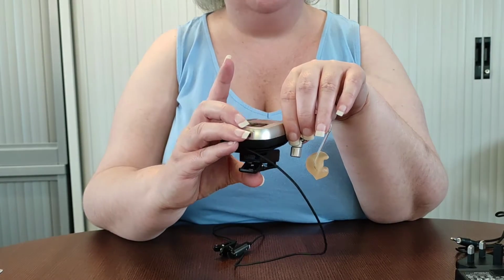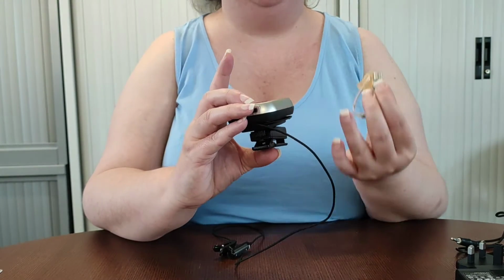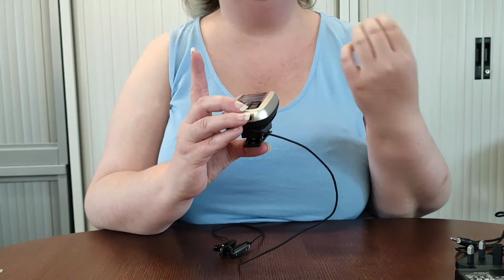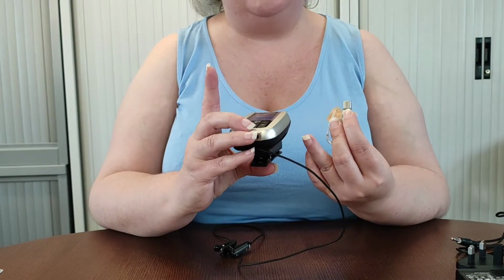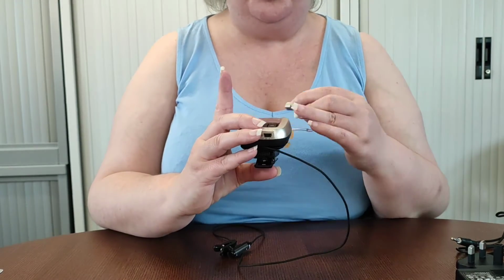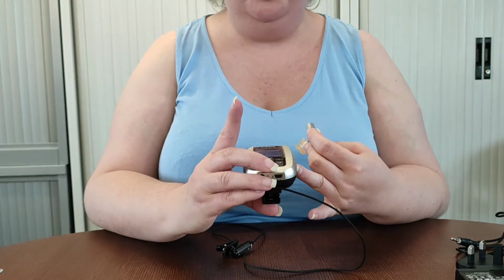And then the screen will say that it's connecting, and then it will say whether it has connected or it has not. In this case it hasn't because it's not actually attached to the hearing aid, but it will be set up by your qualified teacher of the deaf or the technician, so that shouldn't be an issue. If it's connected, then we need to wear it in the position already shown.